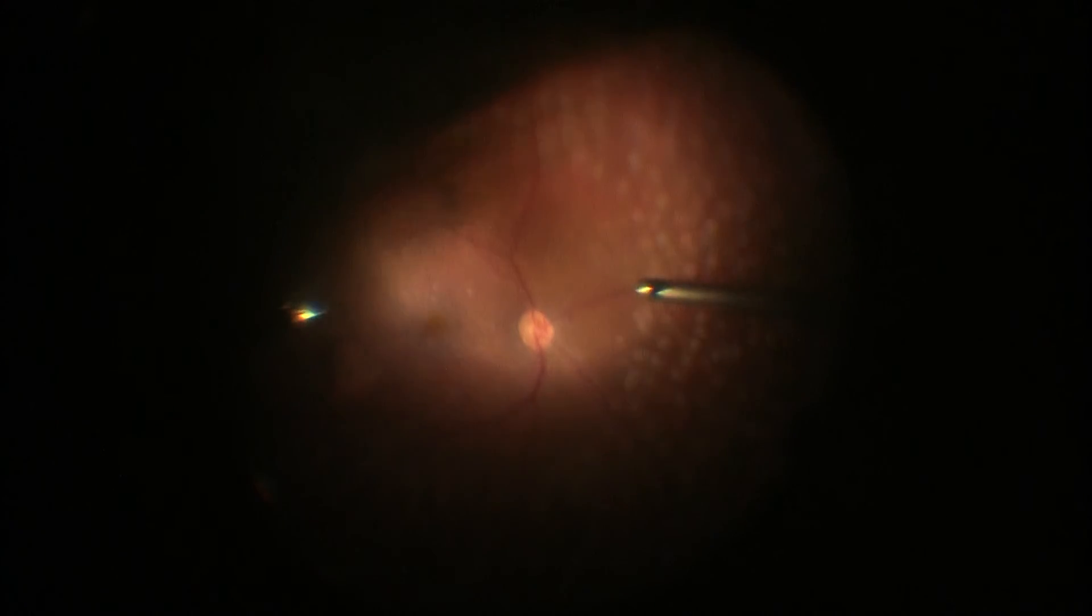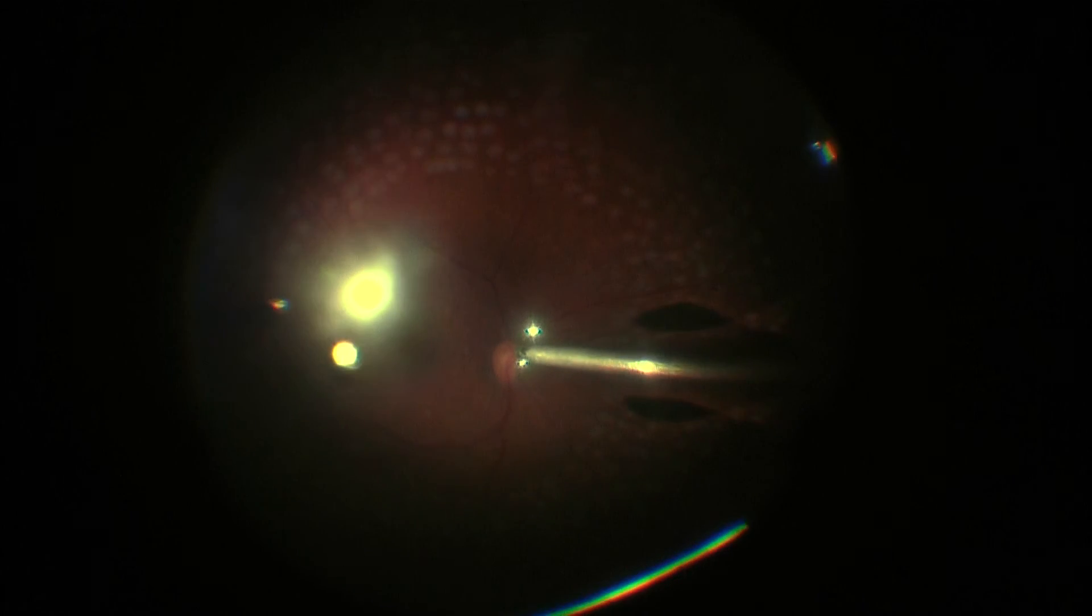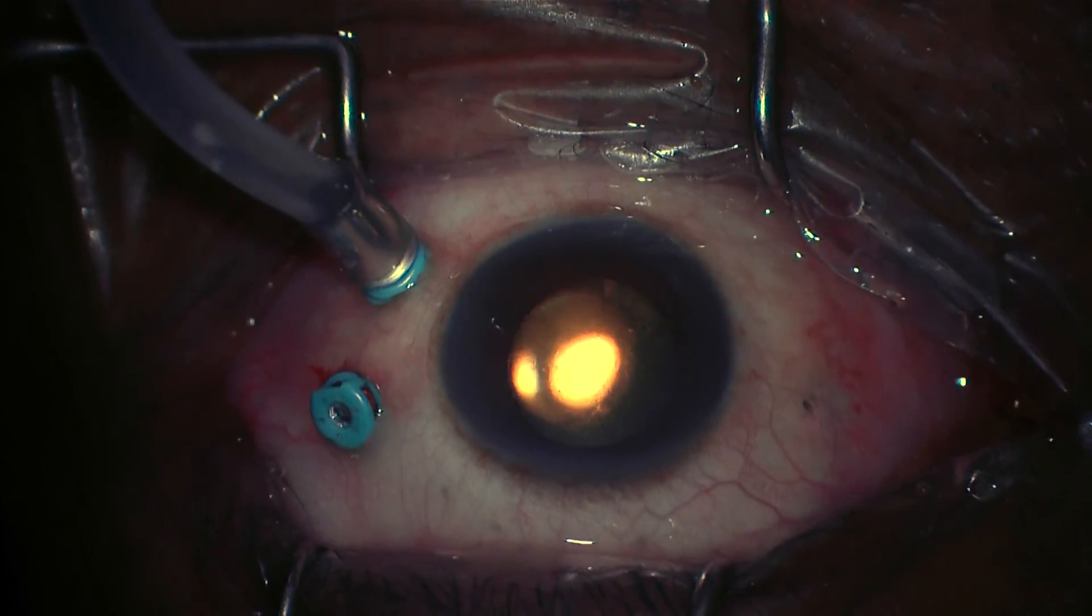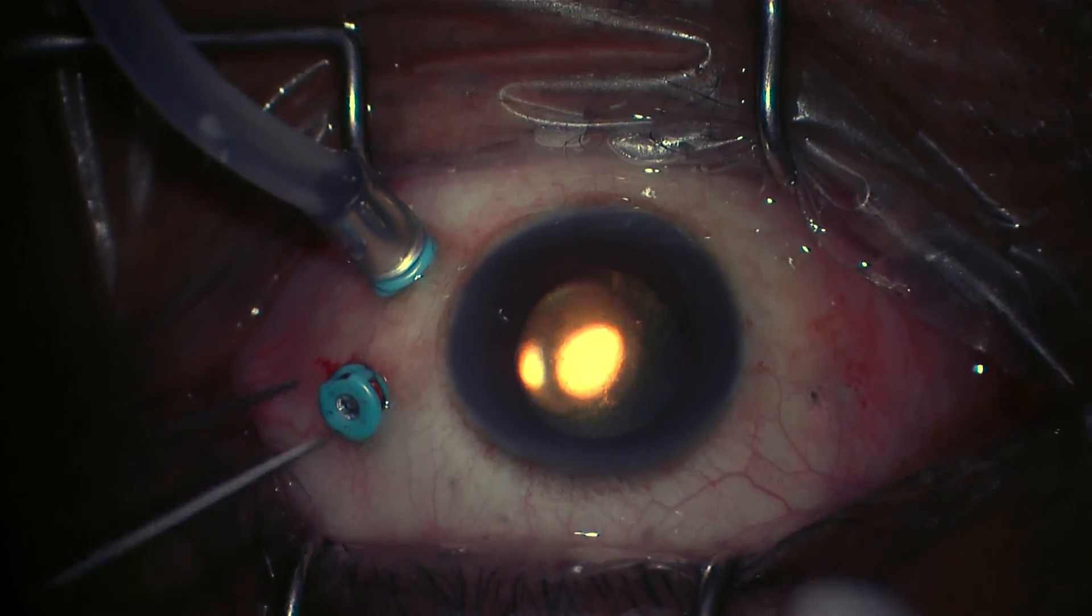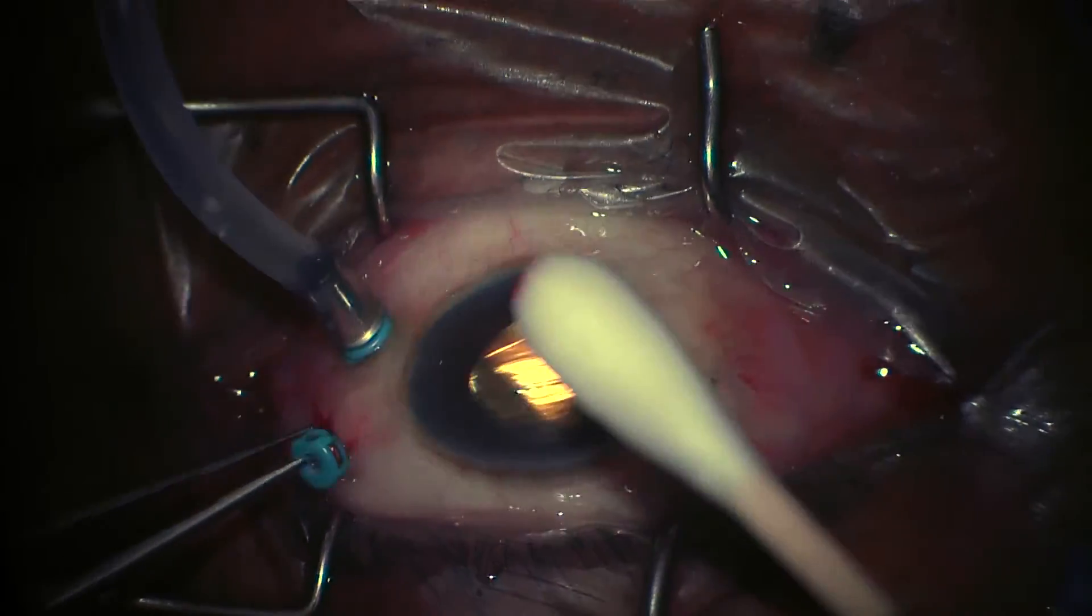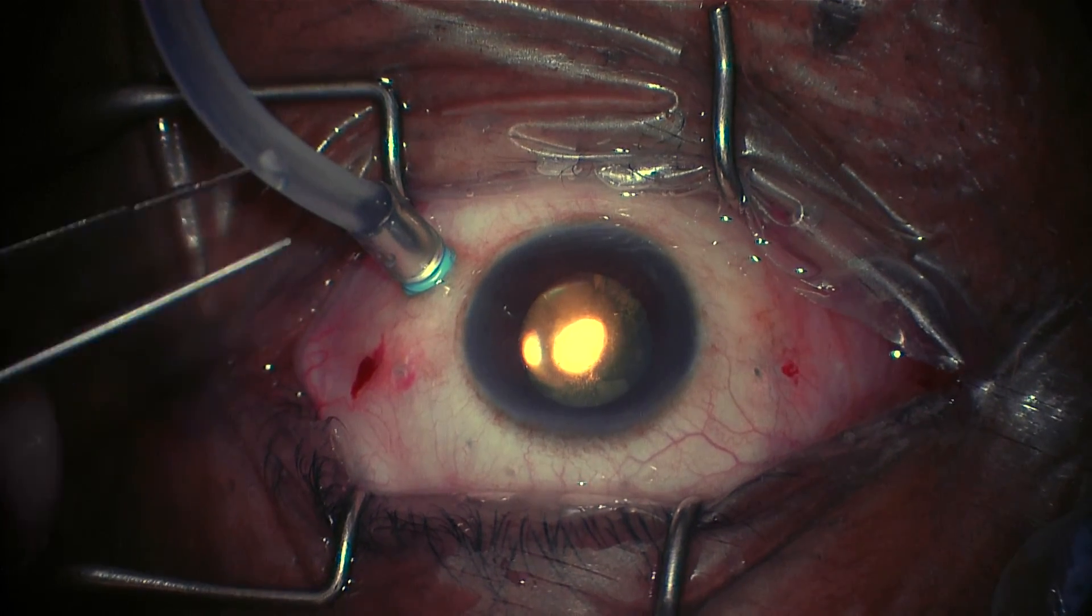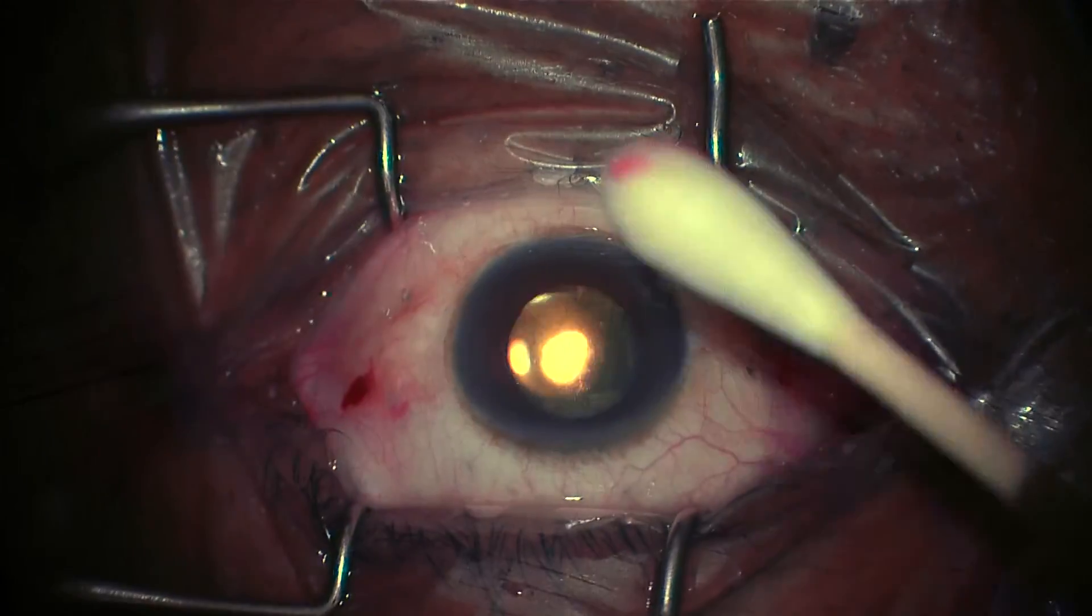After we finish that all around the eye, what we're doing now is performing a final air-fluid exchange and putting a little bit of an air bubble inside of the eye. That light that you're seeing is the reflection off of the air-fluid interface. That little bit of air does also help seal our sclerotomy, so that's an added advantage over here. We're going to remove all the ports and then that completes our case. Thanks for your attention.